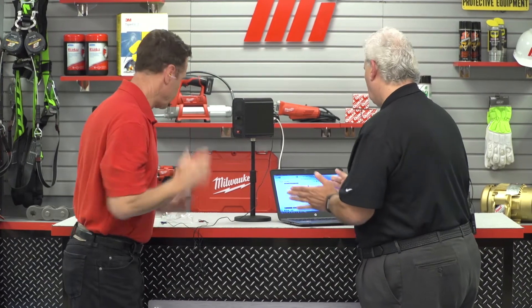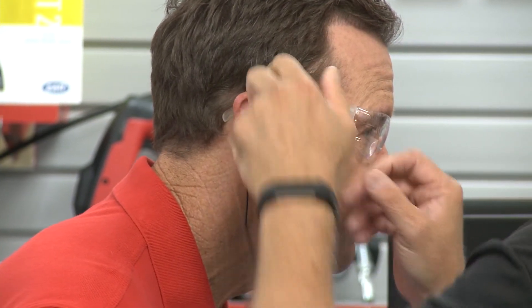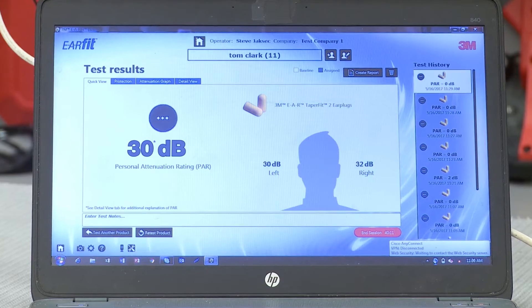That looks perfect. Let's see how well you're going to do this time, Tom. By the way, no ears were hurt in the making of this ear test, just to let you know. Anytime you're ready, Steve, go ahead and press the button. Outstanding. You brought that up to 30 decibels — from two! You could feel it; there was definitely a difference with the earplugs that time. This was a good example of how an EarFit really helped the worker improve their use of earplugs and get better protection to protect their hearing for the long haul.